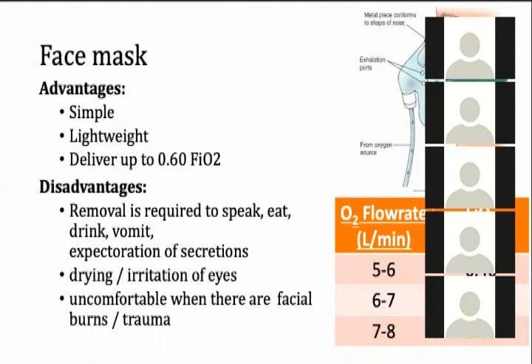So this device is again a variable performance device. Can you see that depending on the flow rate, the fraction of oxygen that is delivered changes? Can you appreciate it?